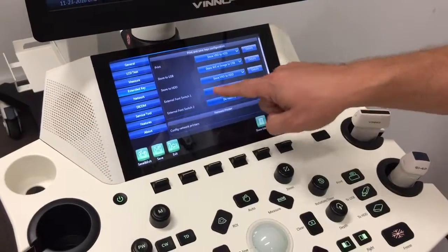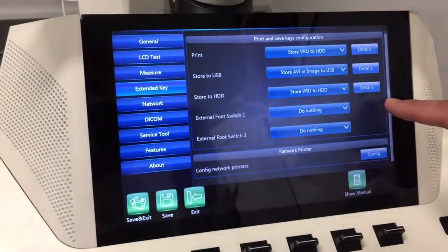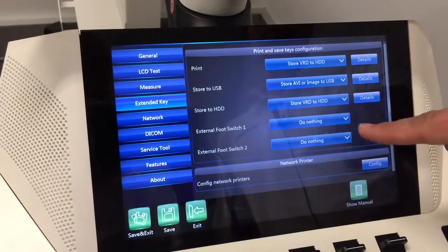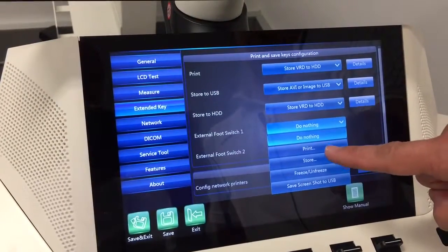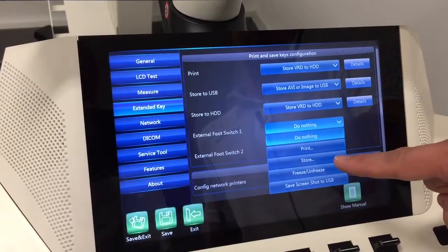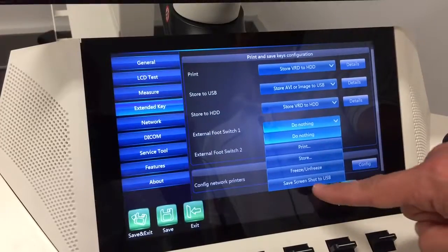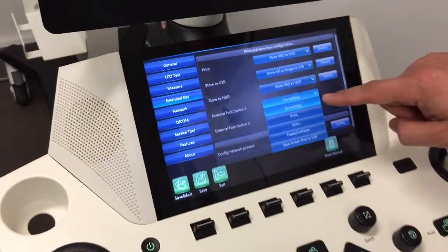Now you have two foot switch buttons. Vino has a single foot switch option and a double foot switch option, so they can be connected via USB. At the moment we don't have it plugged in, so we've got it to do nothing. You can do all sorts of things on this again. You can have it set up for your printer, you can have it set up to store an image. A lot of people like to have it for freeze or unfreeze, and you can also have your screenshot to USB. So again, really convenient option.